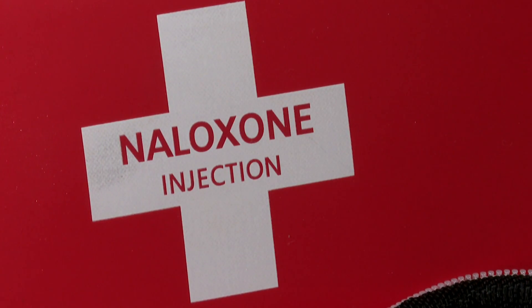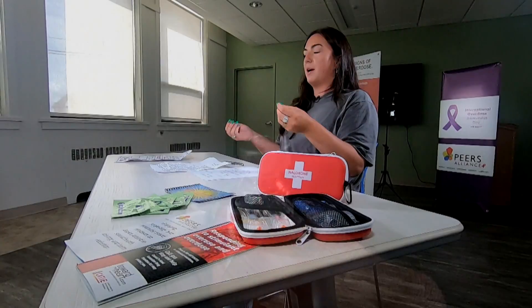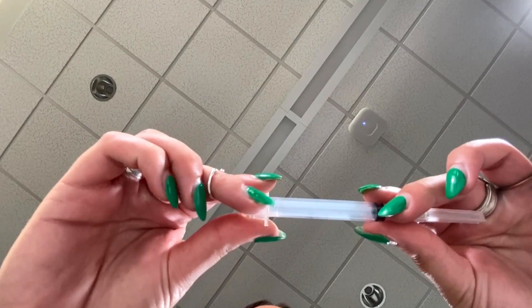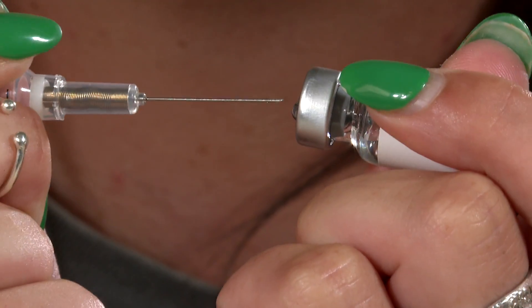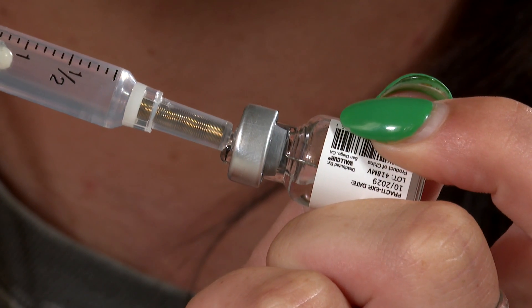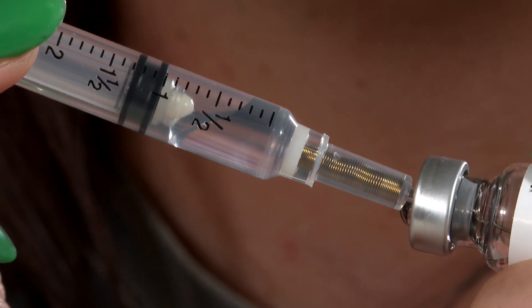With the injection kit, you have a syringe and needle as well as your vial of naloxone. To prepare your injection, take your needle and syringe and pull the plunger up so that the syringe is filled with air. Then put that into your vial of naloxone, push the plunger down so all the air escapes into the vial, and then suck up the naloxone into your syringe.